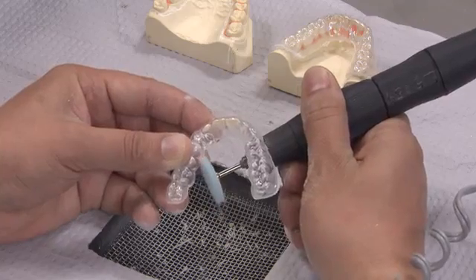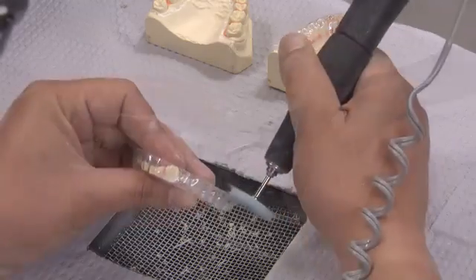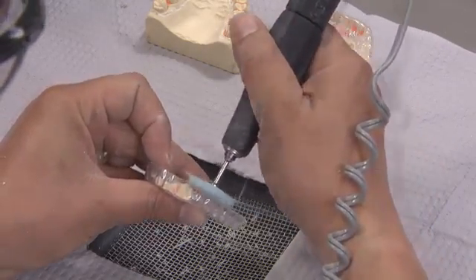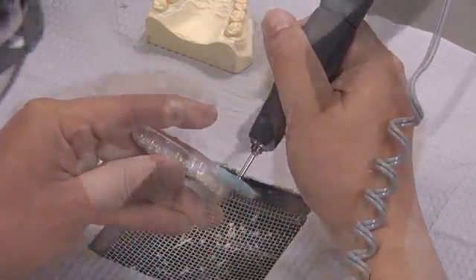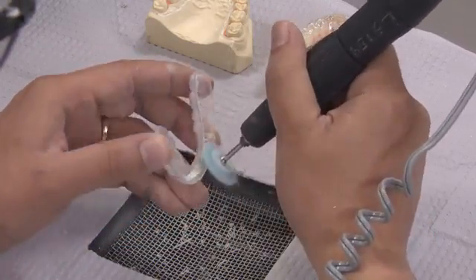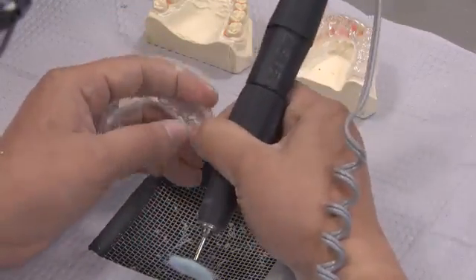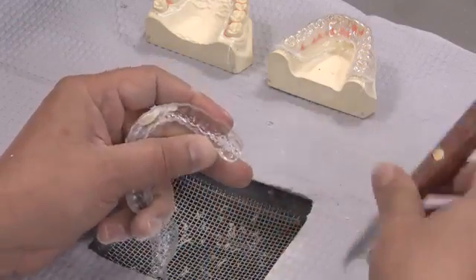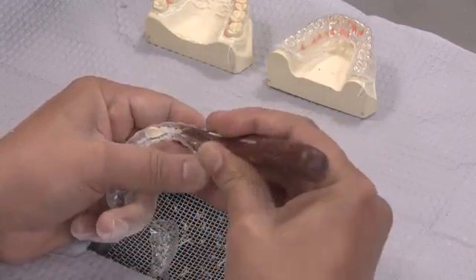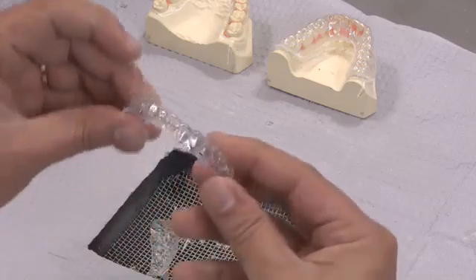Using the blue Lisco disc, refine and smooth all edges. Hold the appliance at a slight angle to round the edges. Remove the inner spacer and any broken teeth from the model with a knife. Inspect the device for accuracy.